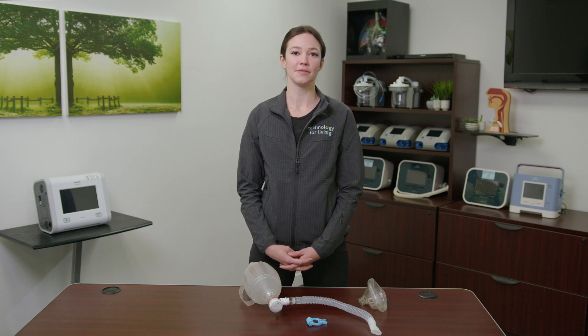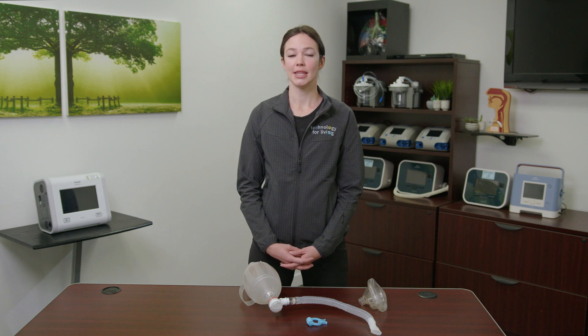A respiratory therapist will have set you up with all the necessary equipment. This video is a visual review of how to complete the technique of breath stacking, or lung volume recruitment, via an ambu bag. This technique is a great maintenance tool for the lungs and is often used to help improve lung function by opening all areas of the lungs.